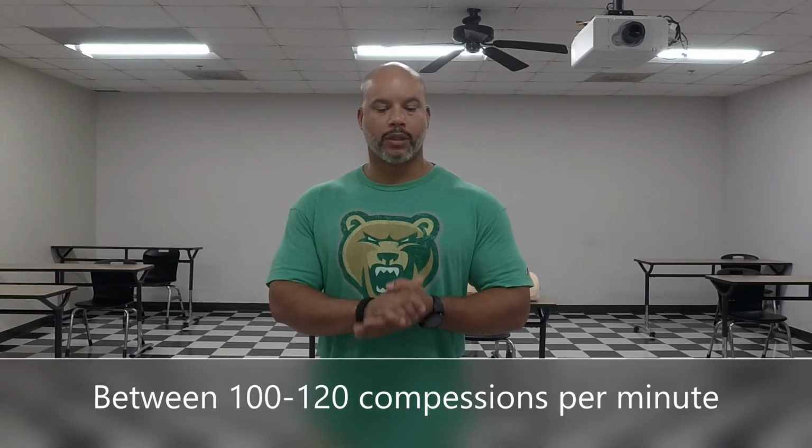The compressions will be done 2 per second, 120 in a minute. Remember to just let the chest return to its normal state after each compression. Follow through with that until you get the AED.